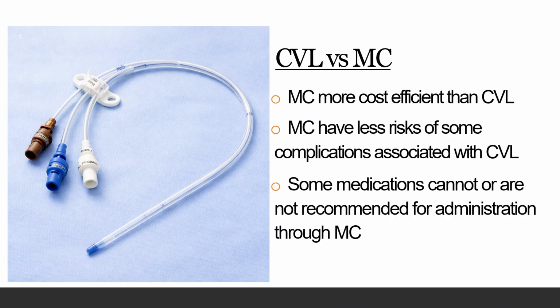So now we've kind of covered midline catheters a little bit. You might be sitting there wondering, well, if I want a longer catheter and something that's safe for the patient, why don't I just put in a central line? You, of course, could. It gives you a lot more lumens typically. Luckily, ChatGPT came to my rescue with this awesome image on the side, but big things to kind of take away is a midline catheter is more cost efficient than a central venous line.